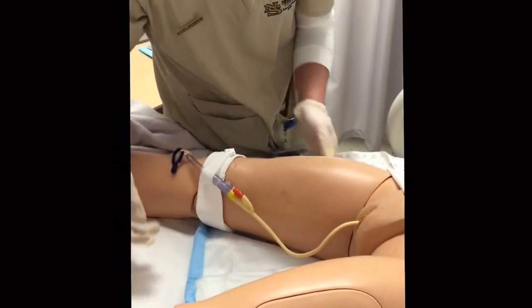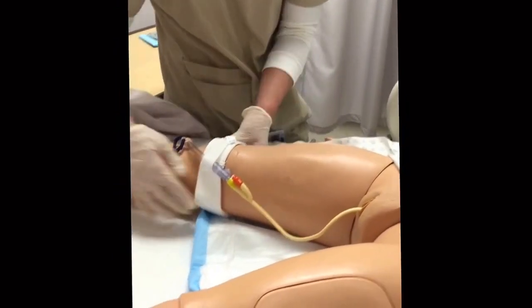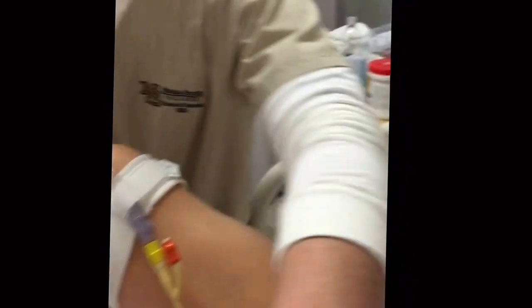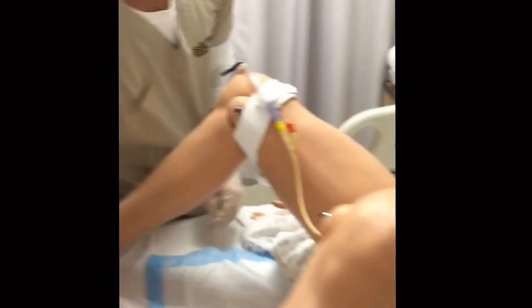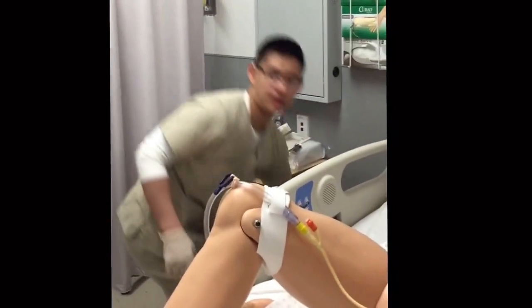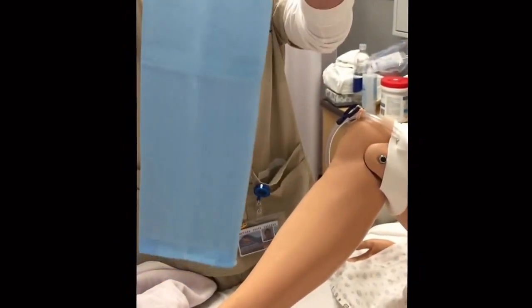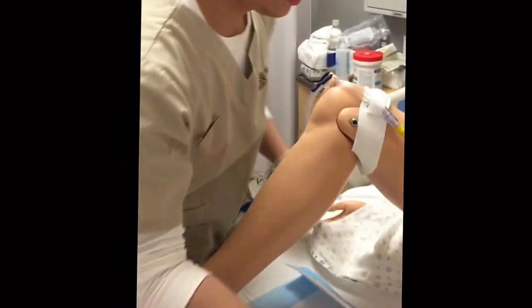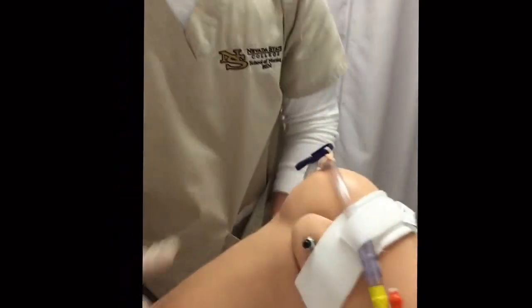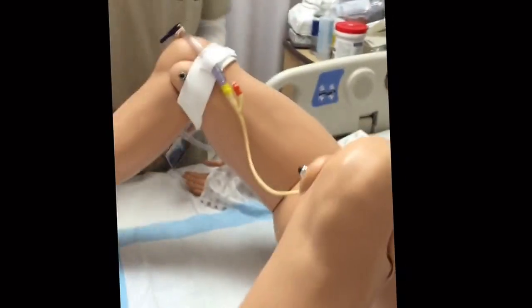So if you can just please lift your legs up for me like what we did last time, okay? Just make sure it's flexed, okay? And then the knees are down like that. That's perfect. Just lift your butt up for me, please. Thank you. And take this off and just replace it with a new chux. Alright. Lift your buttocks up for me again, please. Thank you. That's good. So now that you have that on, we can go ahead and take this off.